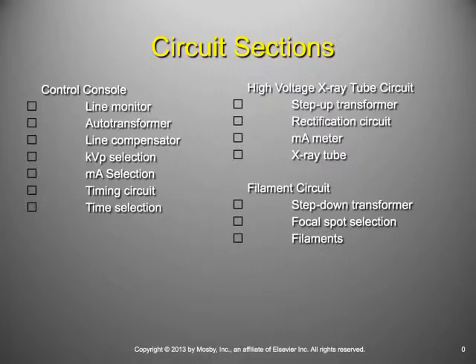And that's also one of the reasons we have these auto transformers. We want a nice line of energy that's coming into this thing. Okay? So all of this section here is really just designed to make sure that if raccoons blow themselves up, it's not blowing out my X-ray tube.